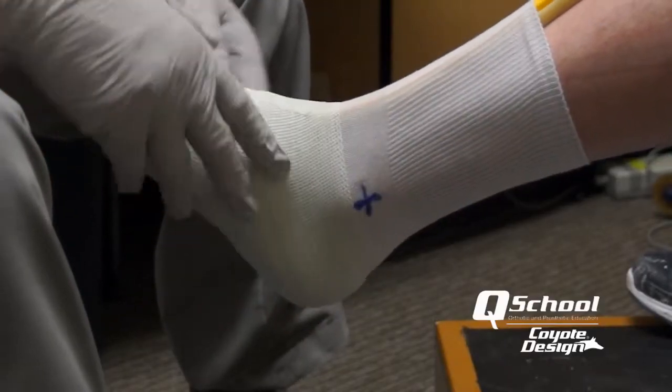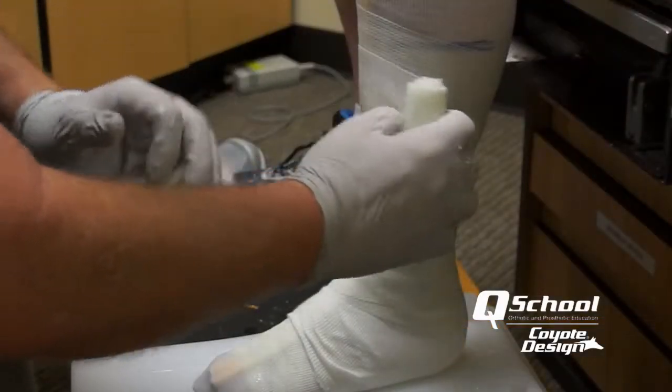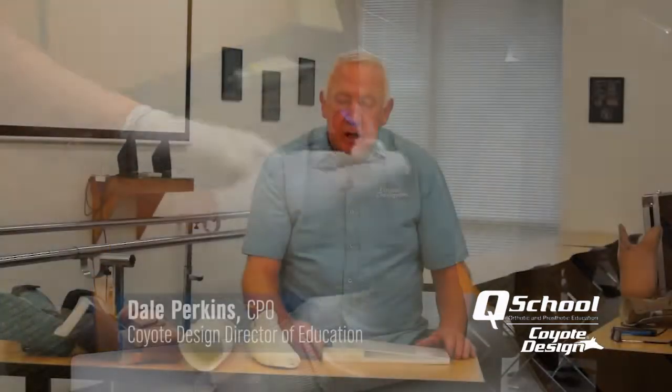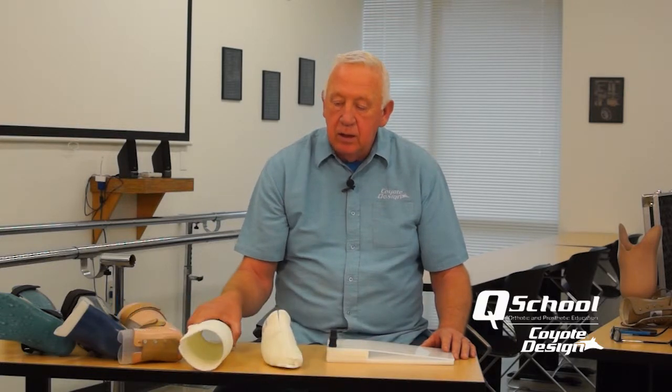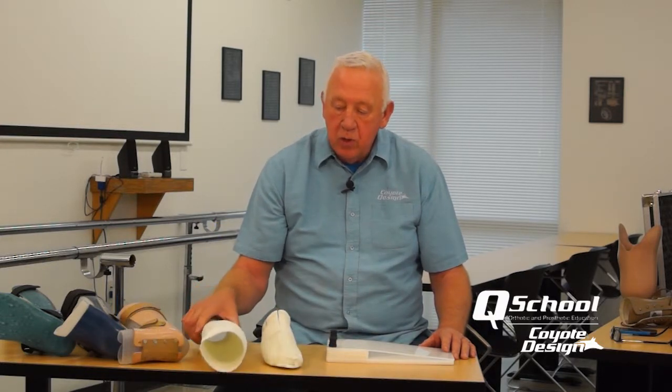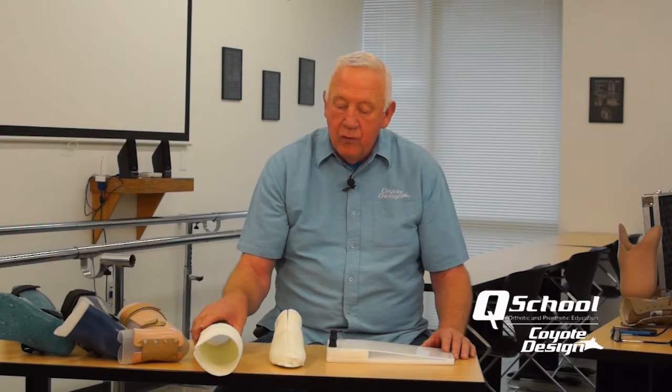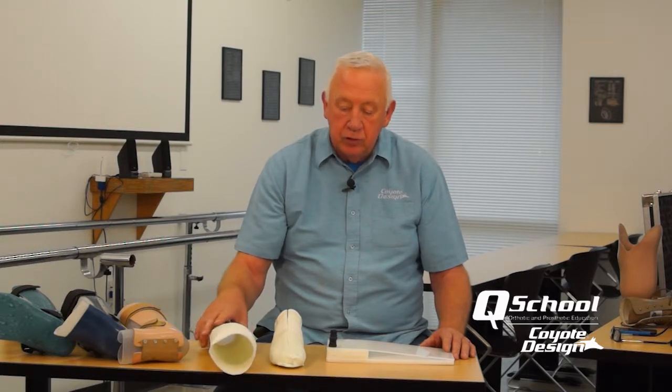We want to go over our techniques for AFO casting and fabrication. The heart of this is the casting technique that we do in fiberglass, typically in two parts for an AFO. We do the foot section first, get it in position, and then do an overlapping mold of the tibial section.